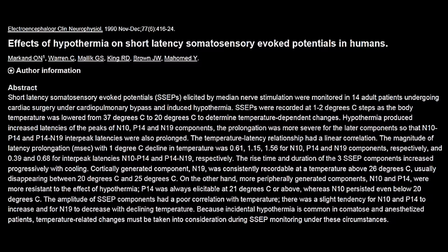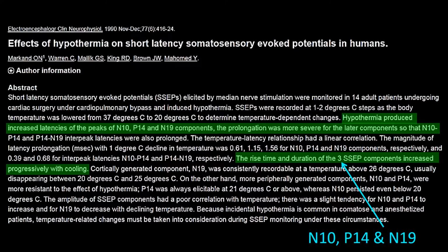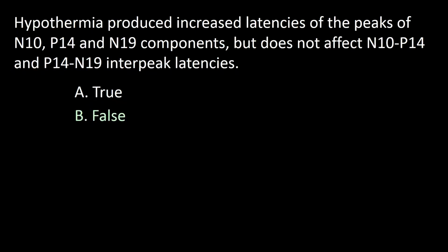This is the only paper I could find which I thought had some clear information regarding hypothermia and somatosensory evoked potentials. In it, you will find the following statements. Hypothermia produced increased latency of the peak of N10, P14, and N19 components. The prolongation was more severe for later components, so that N10 to P14 and P14 to N19 interpeak latencies were also prolonged. Another statement in this paper is that the rise time and the duration of N10, P14, and N19 increased progressively with cooling. So the answer to this question is B.